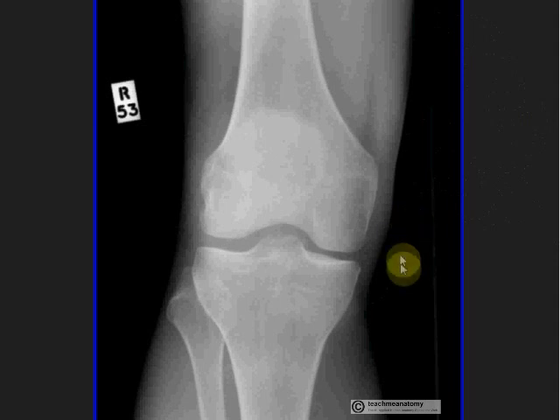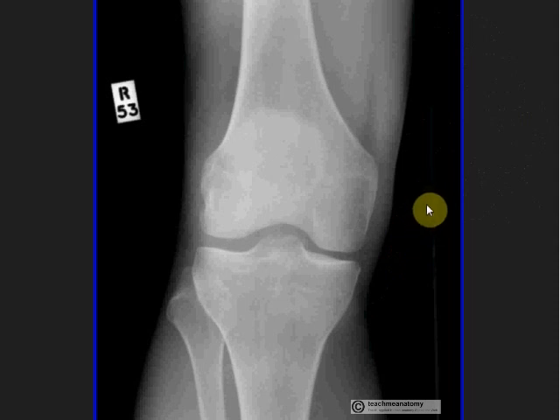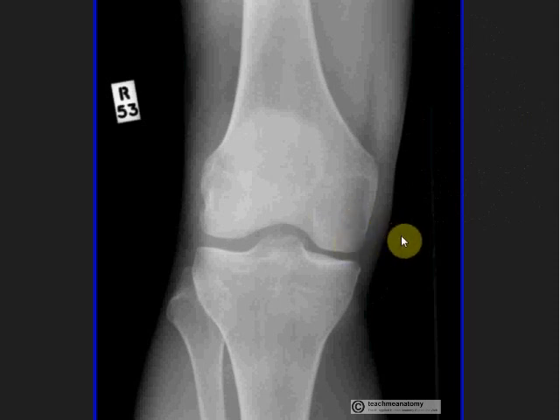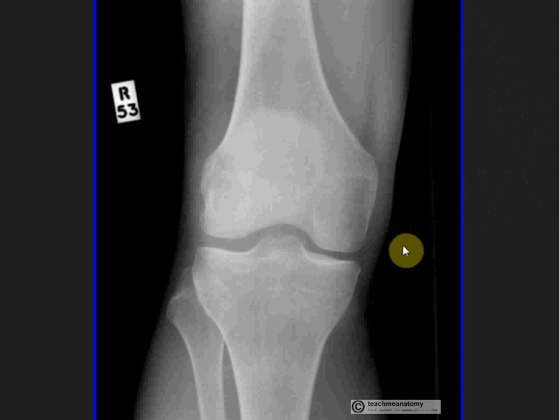You also want to look at the technical quality of the X-ray. I can look at this and say it's of a reasonable quality — the knee is not rotated in the image, it's a proper AP view, and the contrast is good, so I can see a reasonable amount of detail. If the contrast was not correct, you would have either a too dark or too light image, and either way it would not be the best quality to view.